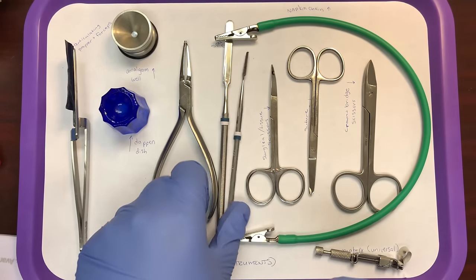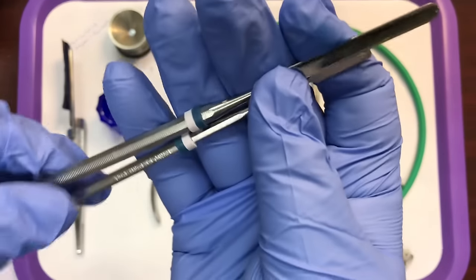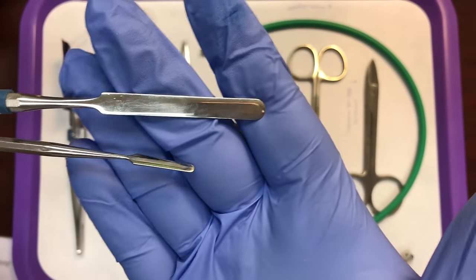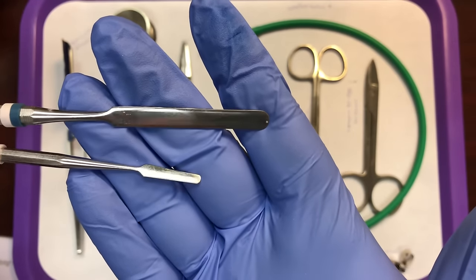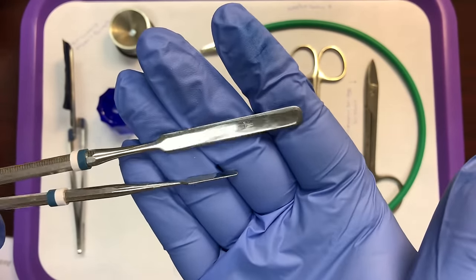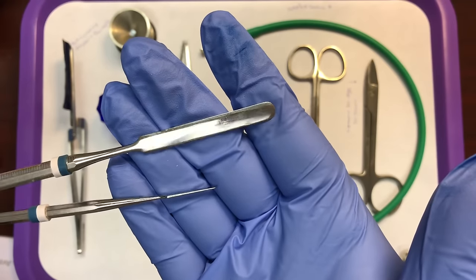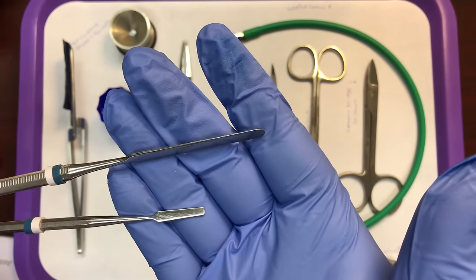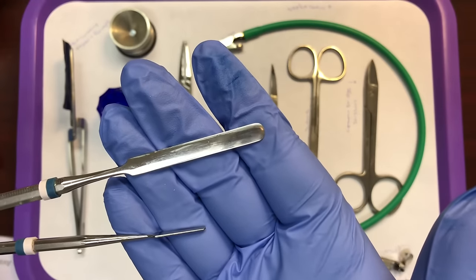Then we have spatulas. There are two different spatulas here — you pick the size based on what you're mixing. There are much larger spatulas used to mix stone and impression materials, but these two are specific to mixing things like cement and temporary filling materials. Whenever you have a spatula, it's going to be used to mix dental materials. These are specifically cement spatulas.